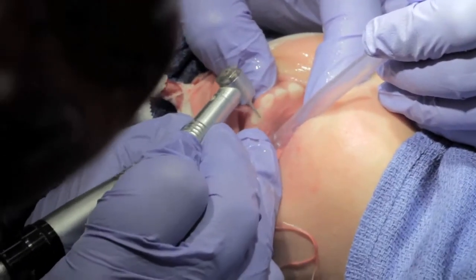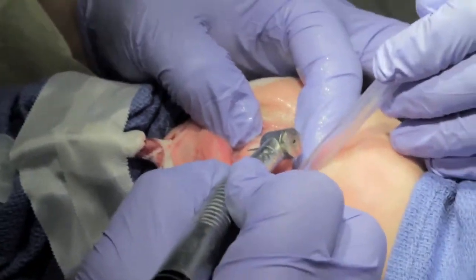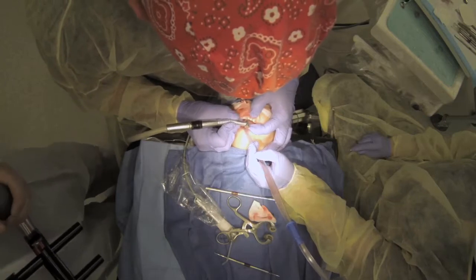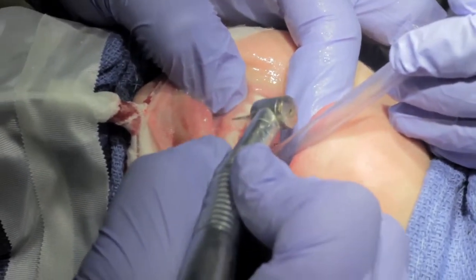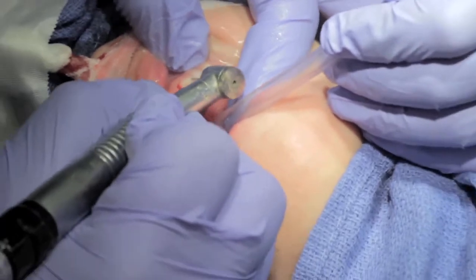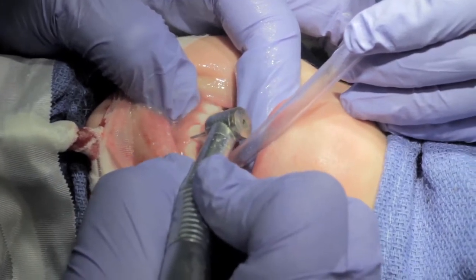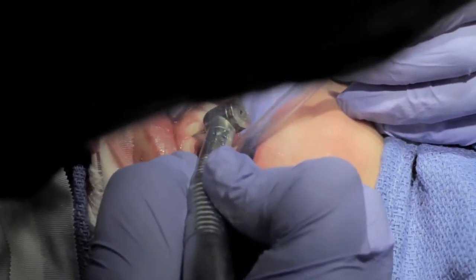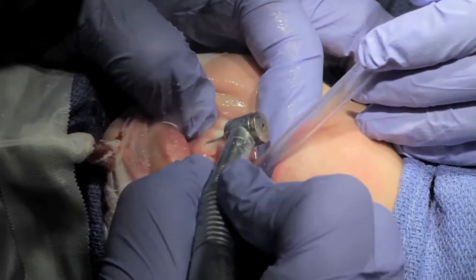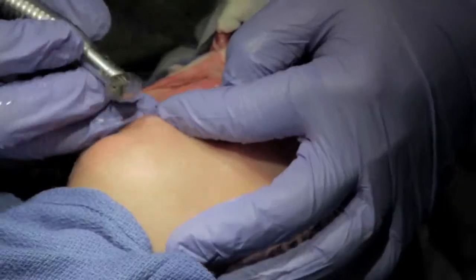We're going to remove the decay, and then we'll cut the crown. We're going to take some off the facial, and a proximal reduction, subgingival all the way, same thing on the distal. Then wrap around the lingual a little. And essentially that's the prep. We'll do the same thing on this side.